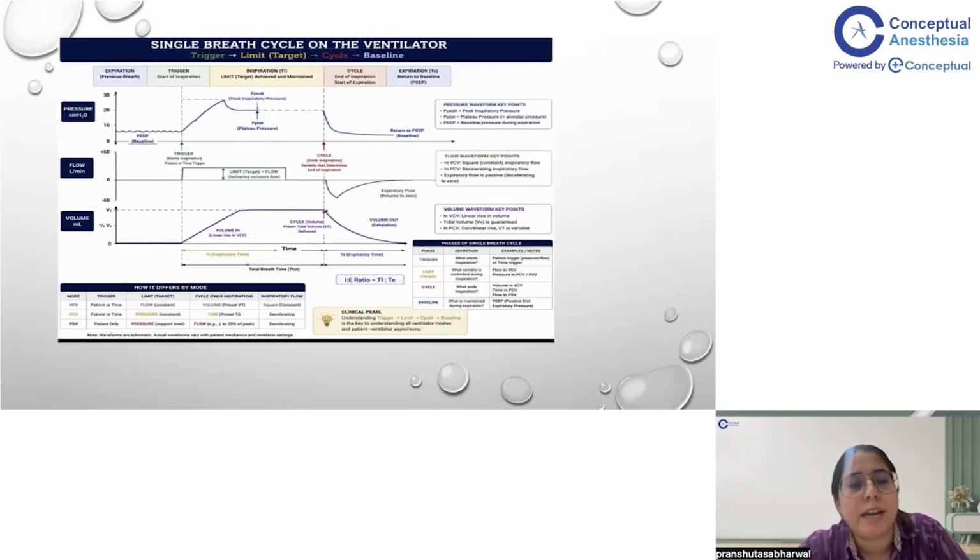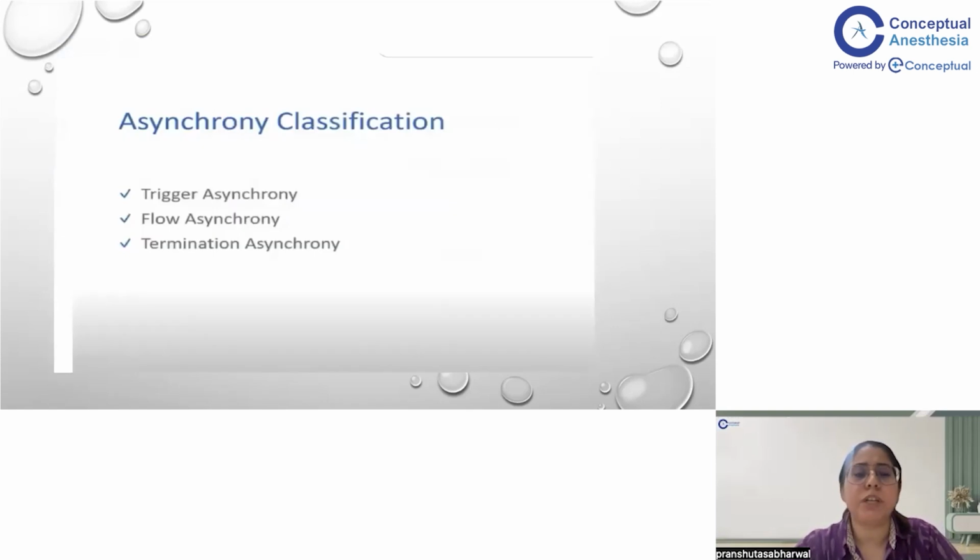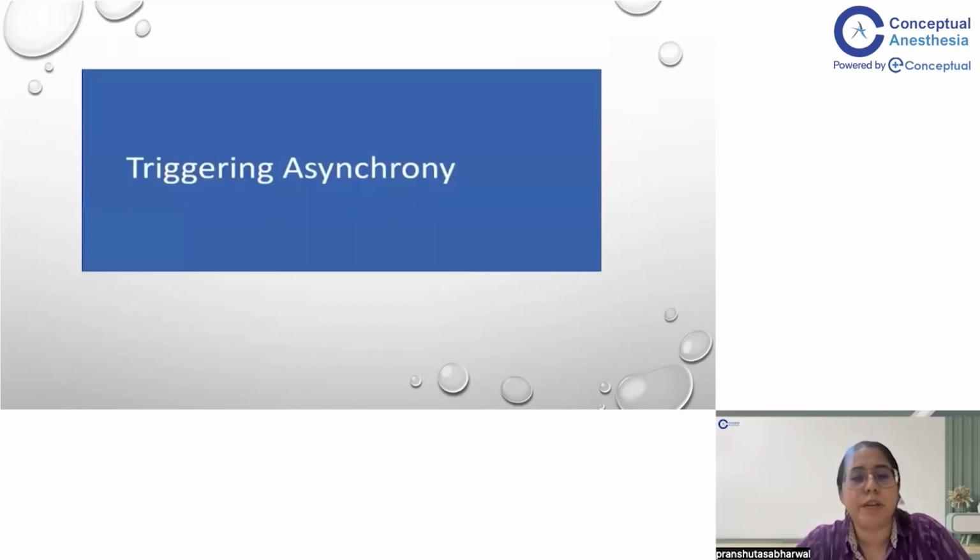So this is the basics, so that you get an idea about the trigger, flow, and cycling asynchrony. These are the three main headings you should know: trigger, flow, and termination or cycling asynchrony. So let's start with the triggering asynchrony.